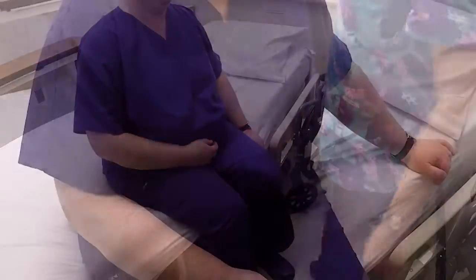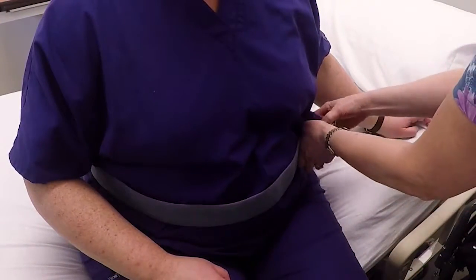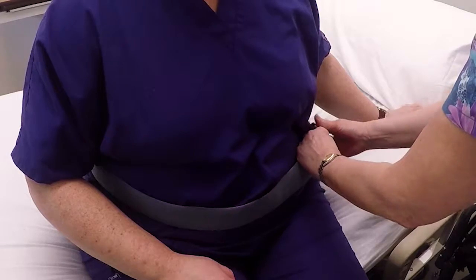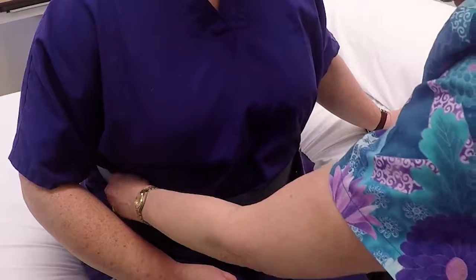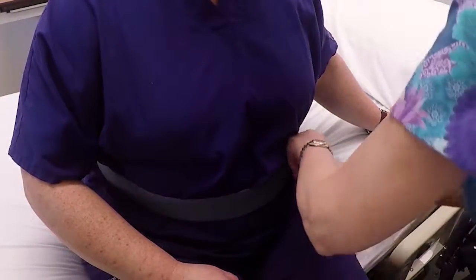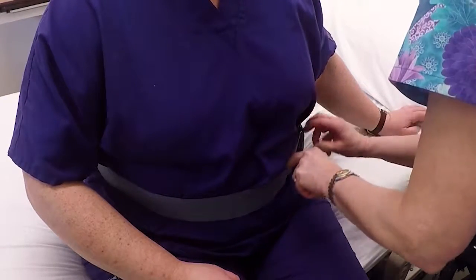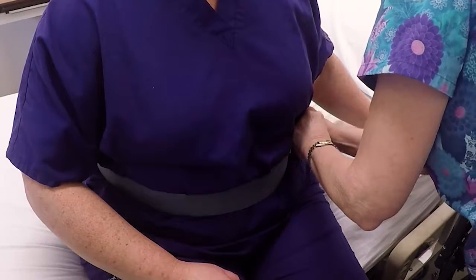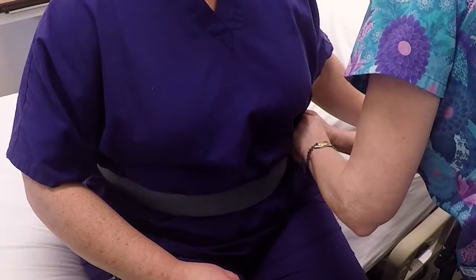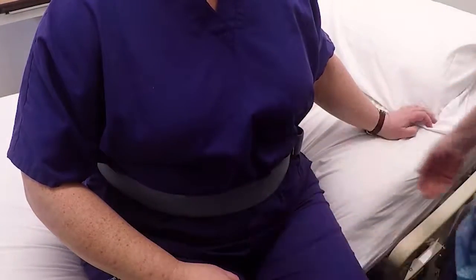Very good, thank you. Next, I'd like to apply the transfer belt. This always goes over clothing and at the waist, with the buckle off to the side. And I'm going to snug it up here so that I can just get about 2 fingers in, complete the buckle here, and snug it up. Till it's snug. Very good.